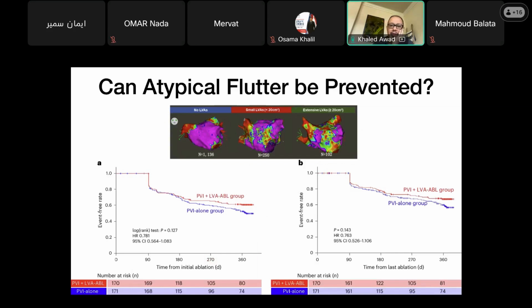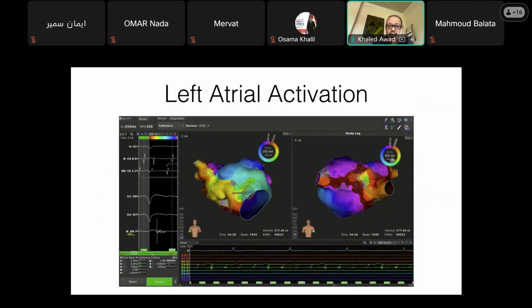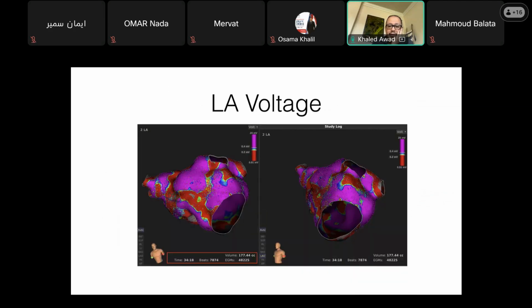Yeah, so some arrhythmogenic cardiomyopathy can be atrial, can be ventricular, can be both, right? And we don't think about it too much when we don't see LV dysfunction, but there are syndromes of arrhythmogenic atrial cardiomyopathies. This is really what we see in a lot of those patients. We just don't give it the right name. And so this patient here, that's an example. Look at the pattern of scar. And so we see a lot of these patients.